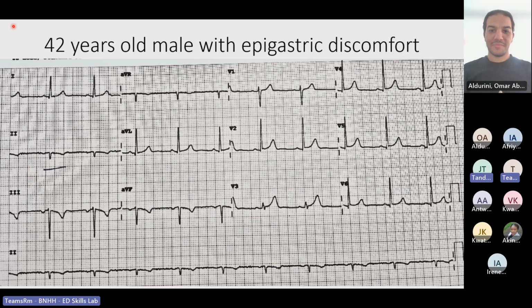Yeah, the T waves are inverted, which is supposed to be, but this second part where you have V1 and V2.